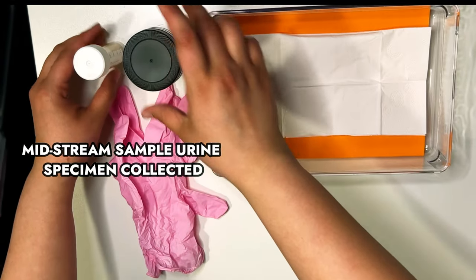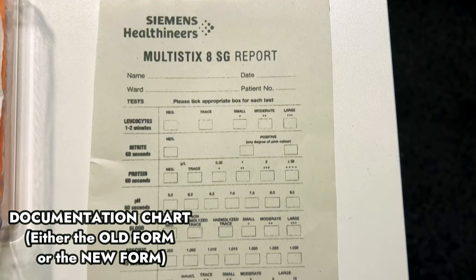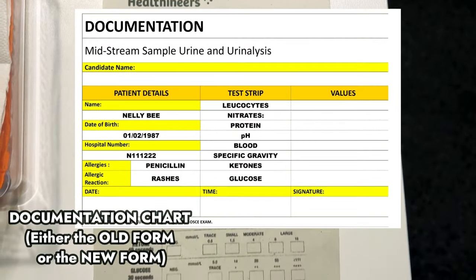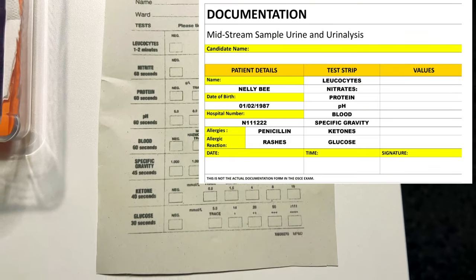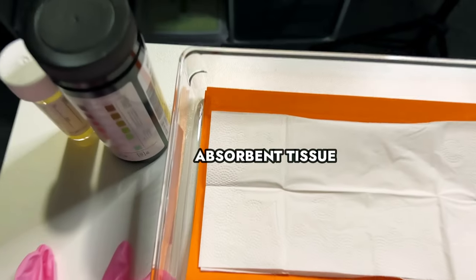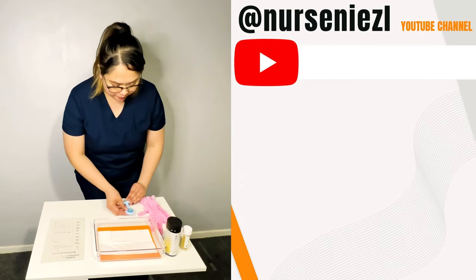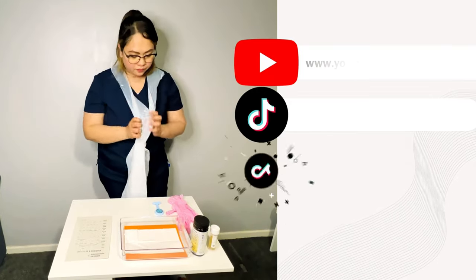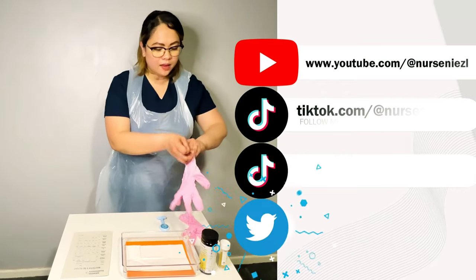Midstream sample urine specimen that we collected. Documentation chart, either the old form or the new form. I will show you how to accomplish both of the forms. Absorbent tissue. Point, we're going to be needing our fob watch. I'm just gonna wear my apron. Wear my gloves.